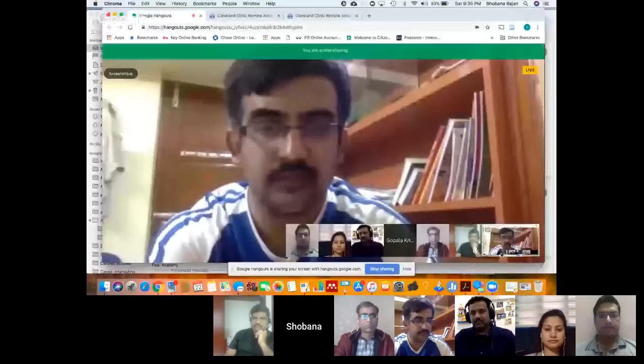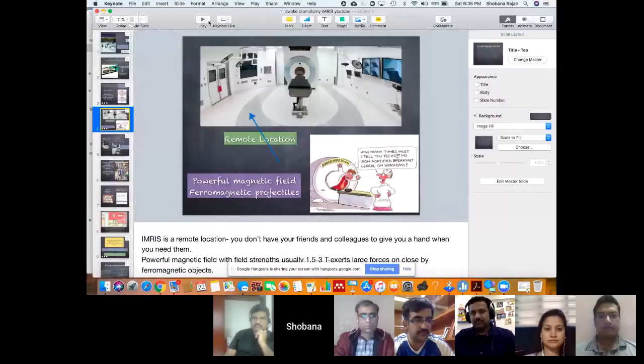Another important question. First of all, I want to say that MRI locations are many times in the basement of the hospital where radiology is usually. And therefore, this is a place where you are alone and you have to handle whatever complication arises. It's not like you have someone whom you can call and they can come there in a few minutes, or as quickly as possible, to help you when there's a problem. Again, I'm going to share my screen with you to show you some more slides.